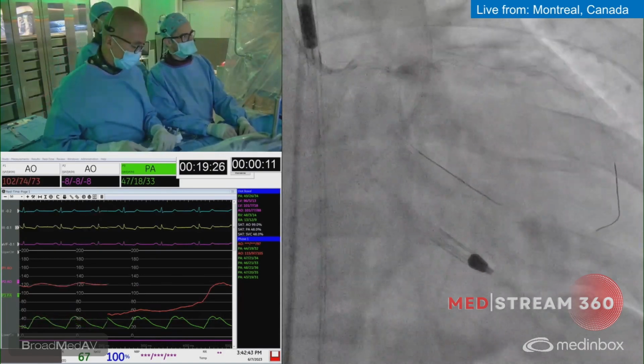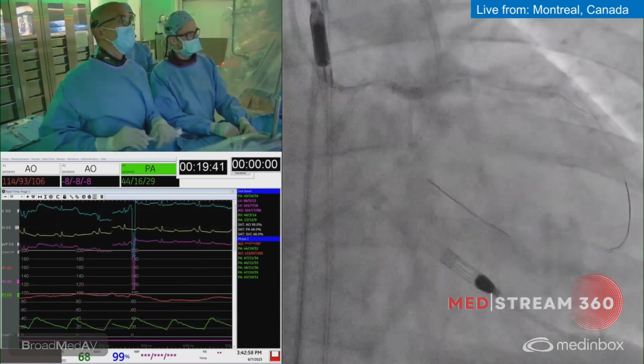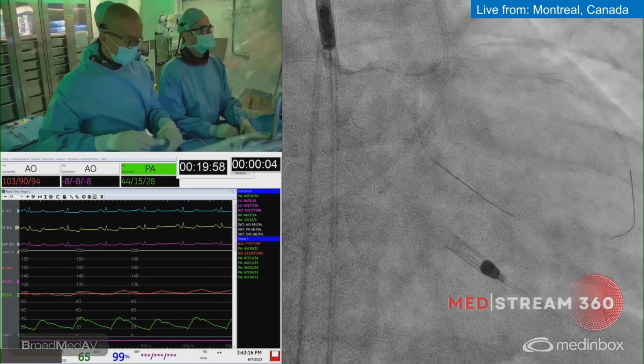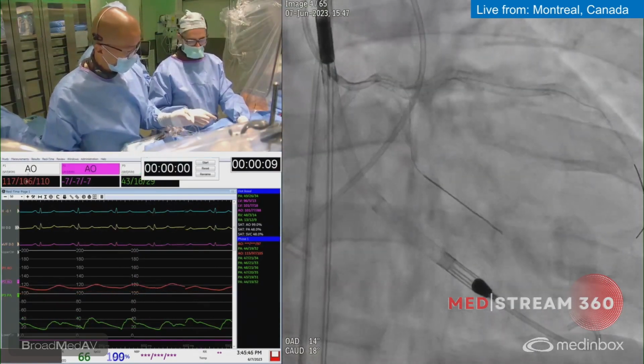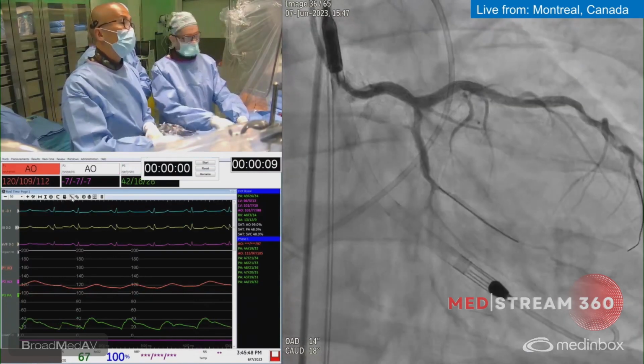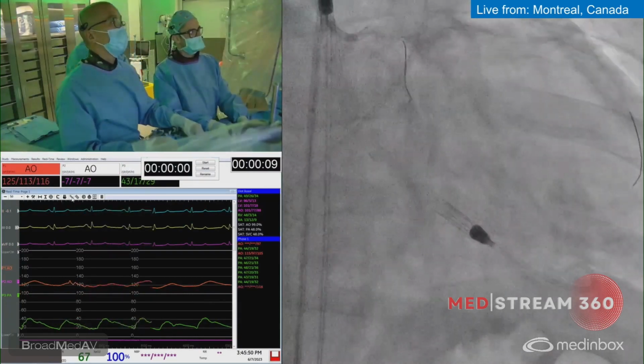We're dilating the left main ostium. Okay, size 16. Take it here. Yep, we're good. I'm going to take the wire from the circ. This is the LAD, the circ wire is cyan blue. Show me. I just want to pull under fluoroscopy, make sure we don't crimp this thing.